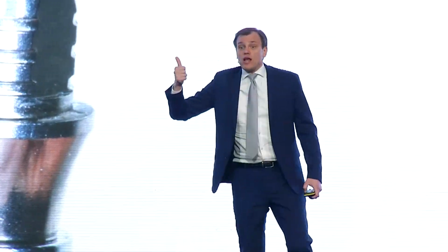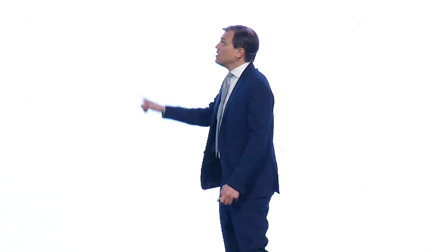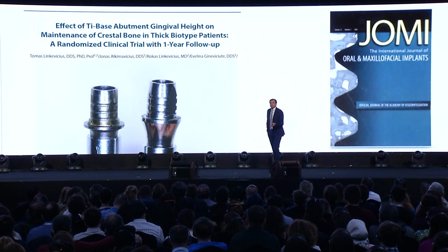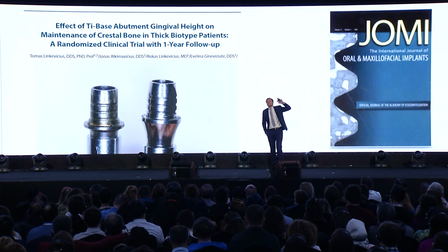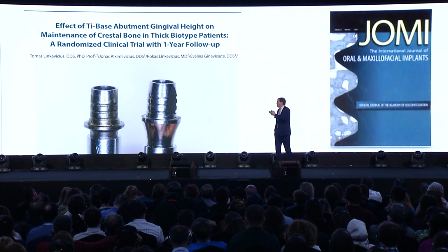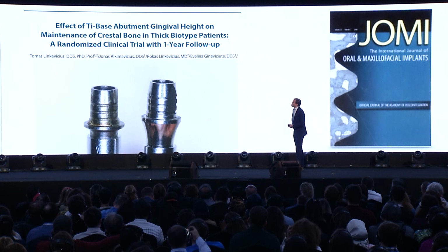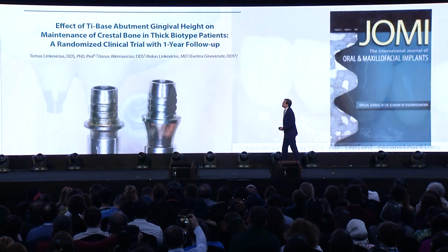Anyway, I am really happy to say, as I already mentioned, that it's published in the best American journal, and I think this is the first publication, right, with NucleOSS implants at this highest level of evidence. And I think that it really puts evidence-based work further.